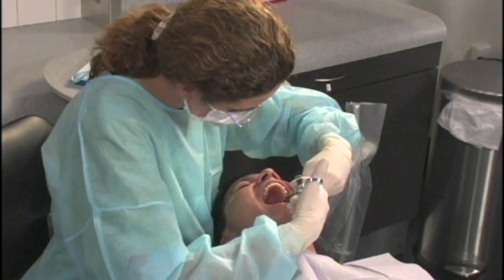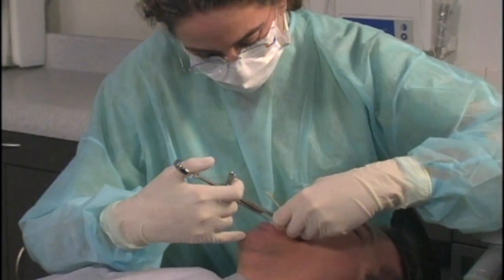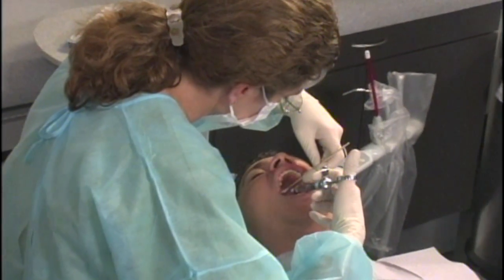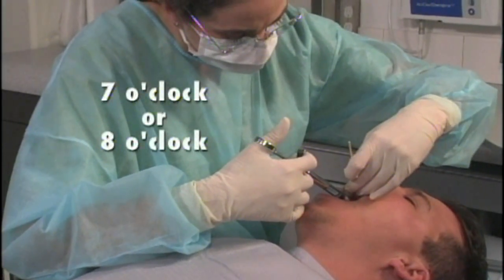For the left greater palatine nerve block, the right-handed operator should sit facing in the same direction as the patient at the 11 o'clock position. For the right greater palatine nerve block, a right-handed operator should sit facing the patient at the seven or eight o'clock position.